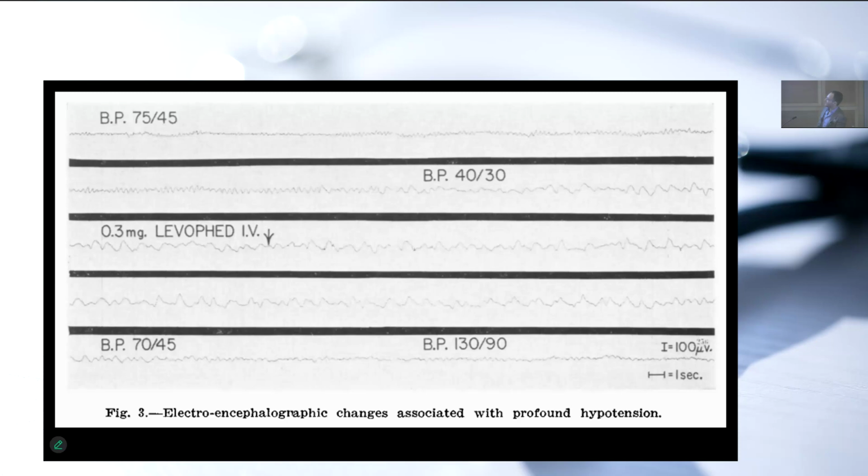So they see that, hey, here's a patient who we would be satisfied with this, or we don't know if we'd be satisfied, but certainly the transition from this state to this state was associated with an abnormal and unacceptable change in the EEG, which is corrected by administration of a vasoactive agent.